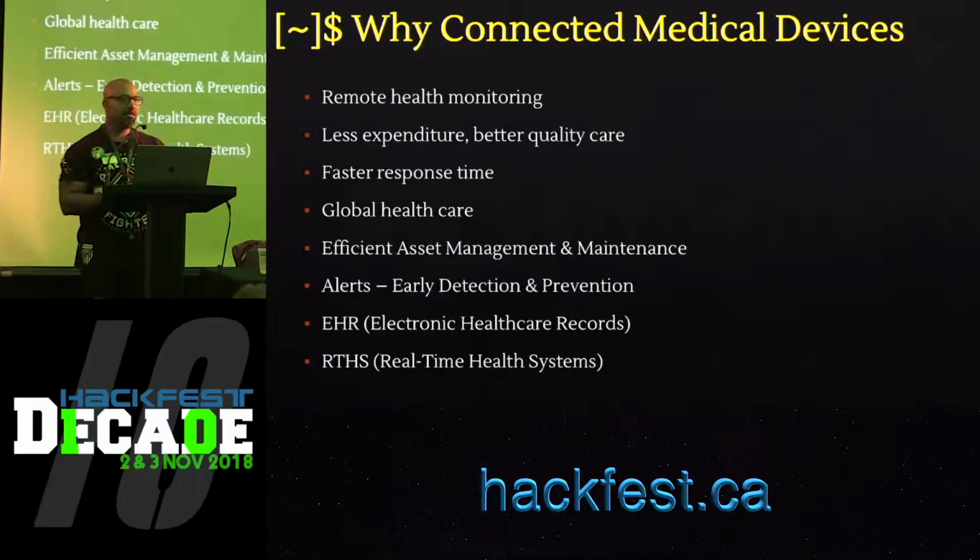All right, so I think I'm done with time filler slides and just going to jump onto case studies now. So the first medical device that we looked at was an IV infusion pump. An infusion pump is usually used to inject fluid, nutrients, medication into a patient's body in a controlled and appropriate dosage.